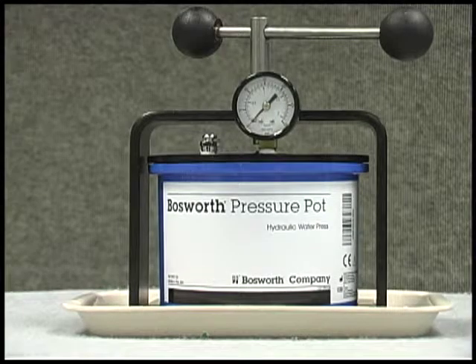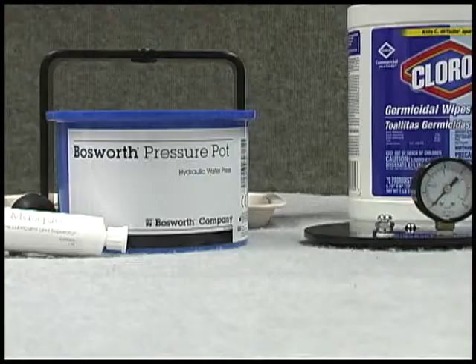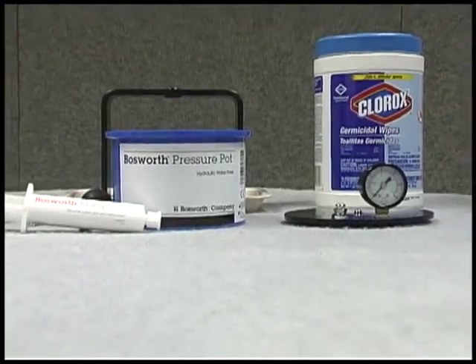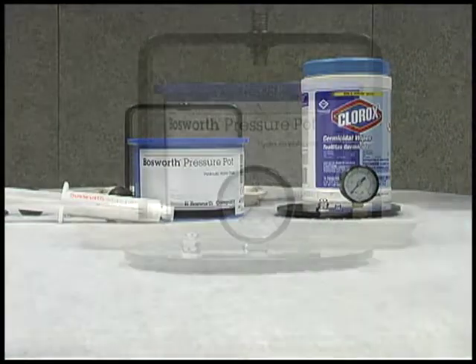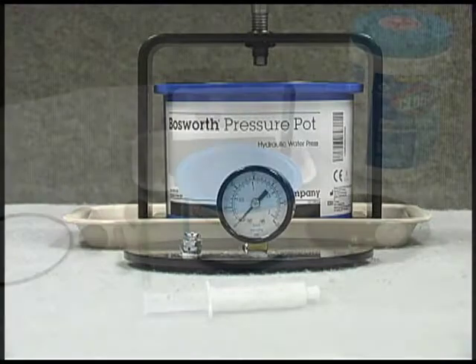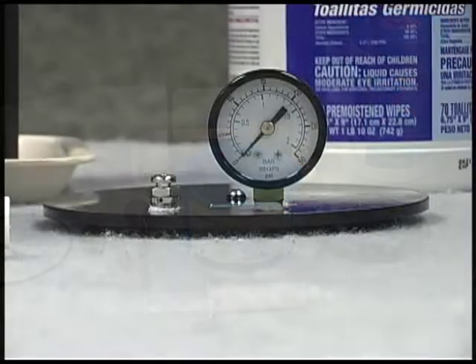Bosworth's Pressure Pot is a hydraulic design press used to create relines, repairs, splints, temporaries, and orthodontic appliances. The Bosworth Pressure Pot aids you in creating a better, longer-lasting material that is porosity-free, color-stable, and a harder appliance without shrinkage.